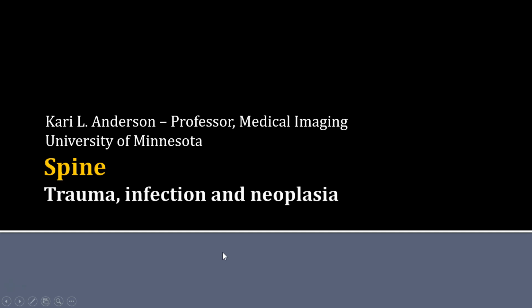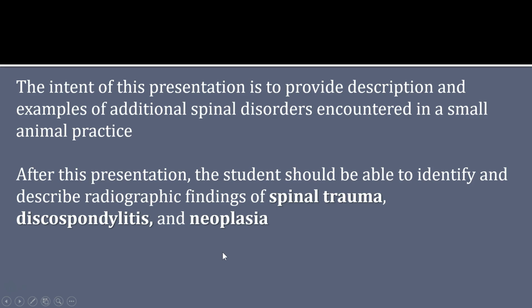Welcome to the fifth in the series of presentations on spinal radiography. The intent of this presentation is to provide description and examples of additional spinal disorders encountered in small animal practice. And those additional disorders we'll speak about include spinal trauma, spinal infection, specifically discospondylitis, and spinal neoplasia.